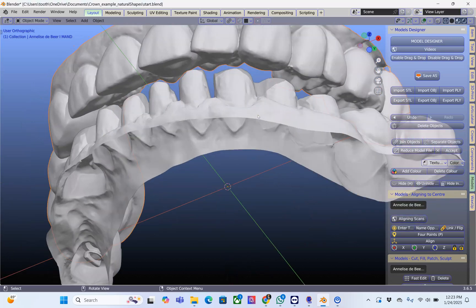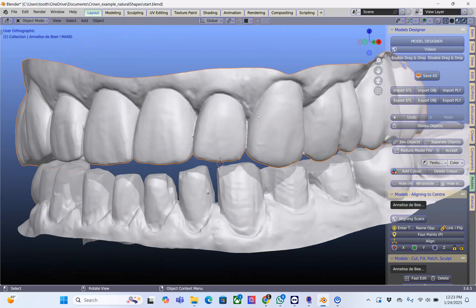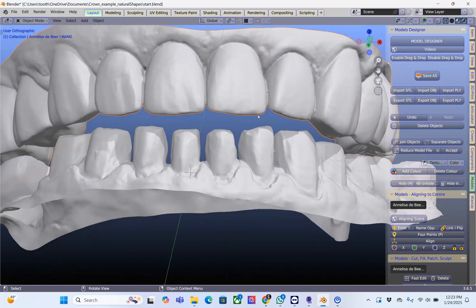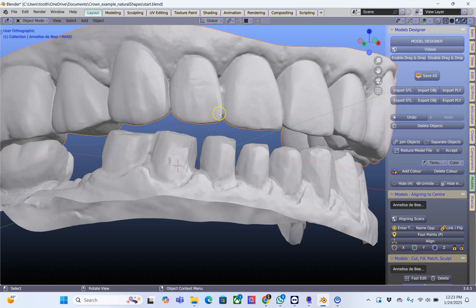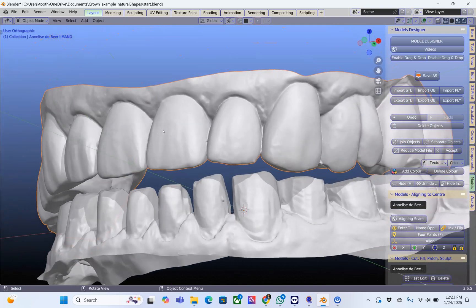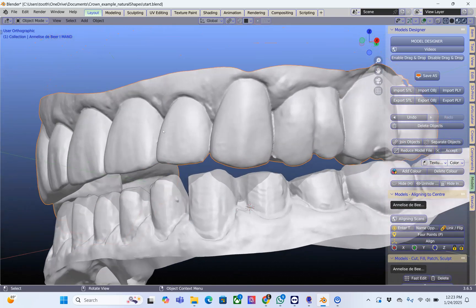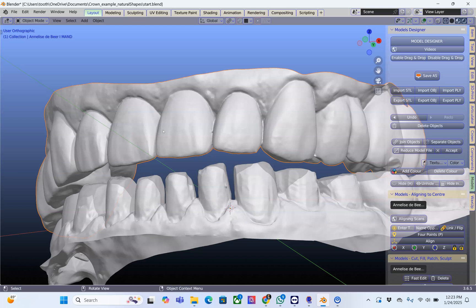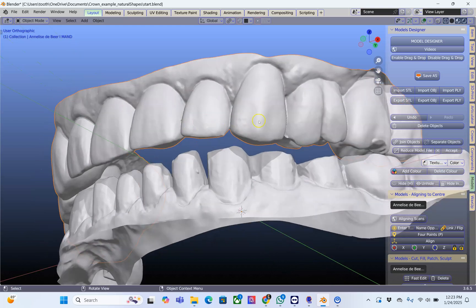In this video I'm going to show you how to use the articulator to cut a tooth library to use for these crowns and veneers.